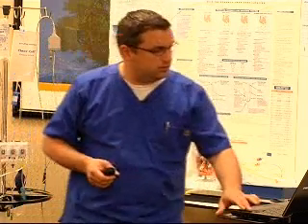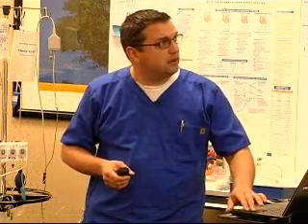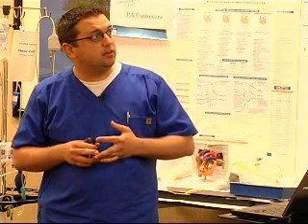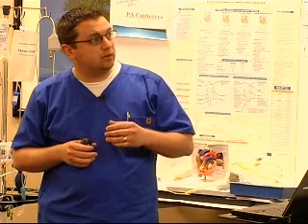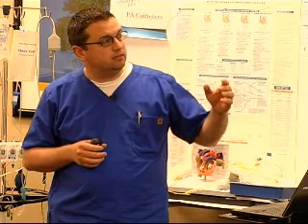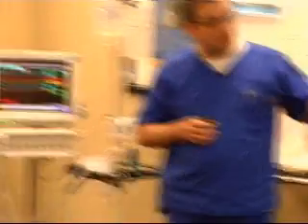All right, let's go on to the next one. This is just a correlation example of arterial, PA, and your basic EKG rhythm. It gives you an example as to where that phase is, your dicrotic notch, and how that falls on the PA waveform.